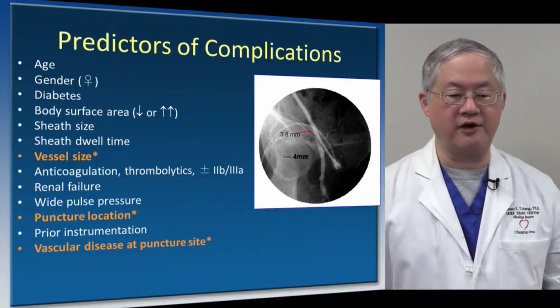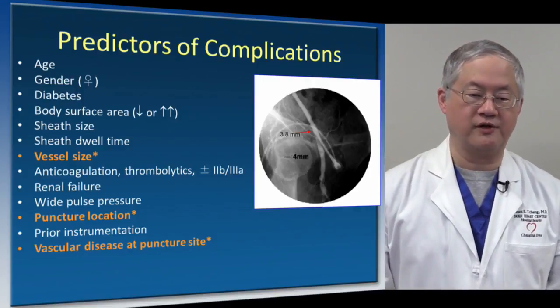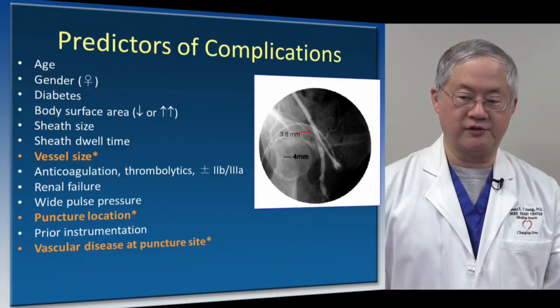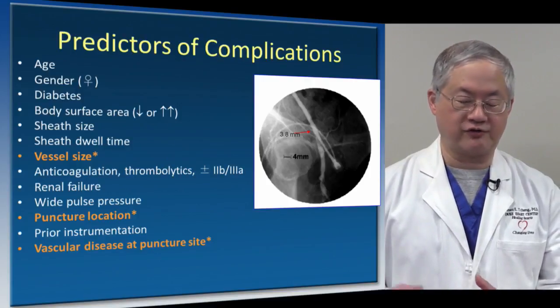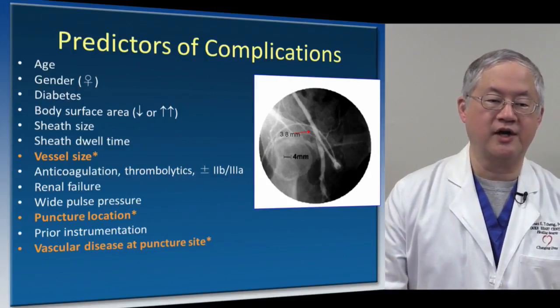But how do you know you're there? You won't know unless you take a femoral angiogram. So one of the criteria that I like to judge our fellows by is when they do the femoral vascular access on femoral angiography, have they hit the lesion at the right side?